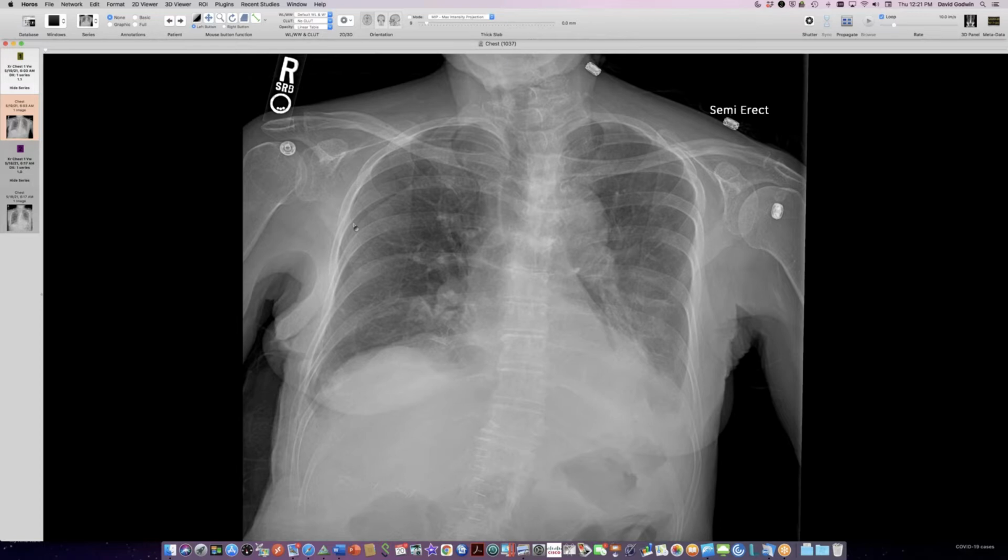Okay, great case. So what you're saying is if we can have malleable detectors like some of these new foldable phones, we could eliminate the skin fold artifacts if they conform to the patient's body. That's right. Okay, and that will be an important technical advance. So we ought to really concentrate on doing that. I think it's going to be too fragile. Retire early.